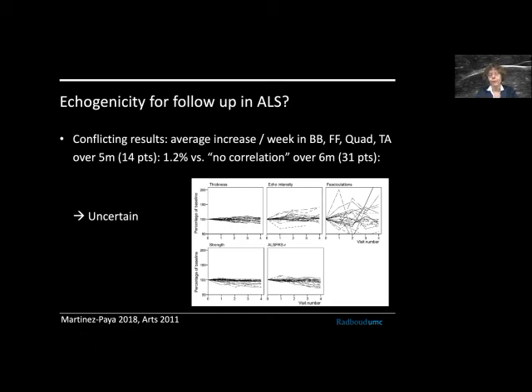And I think we've already discussed why muscle ultrasound is not good for follow-up here, because on the one hand, fasciculations, which are a major part of the diagnostic value, tend to become less. And on the other hand, patients also have central motor neuron pathology, which will impact their function and prognosis. And that's also not accounted for in the ultrasound measurements. So good for diagnosis, less so for follow-up.